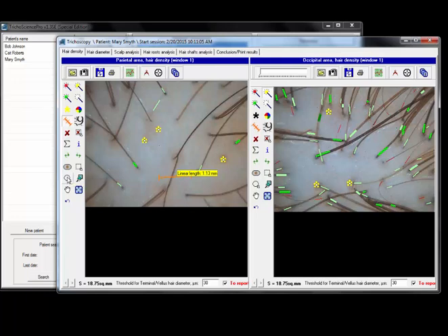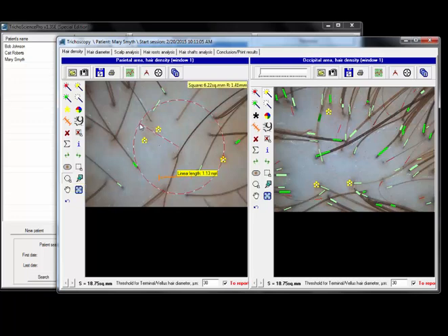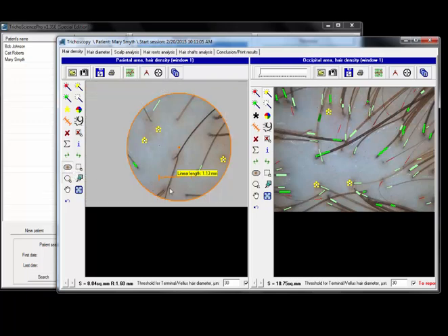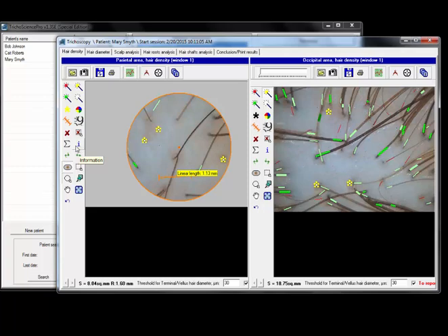Another feature I'd like to show is the select circle area tool. I can just use this to zoom in, kind of clear off the rest of the picture just by clicking this button. That allows me to focus on just this particular region. A lot of the rest of the tools are pretty self-explanatory, so I recommend reading the user manual to find out more about those.